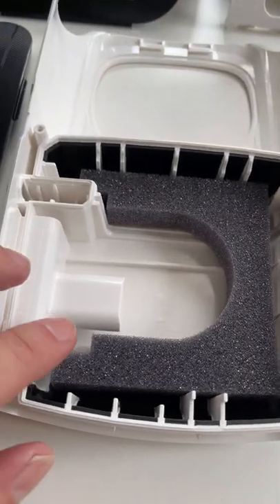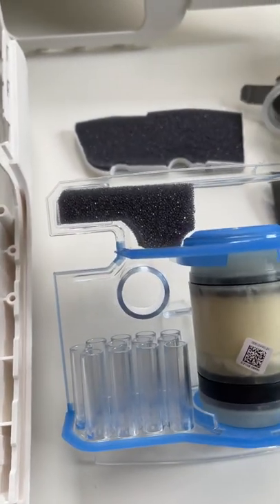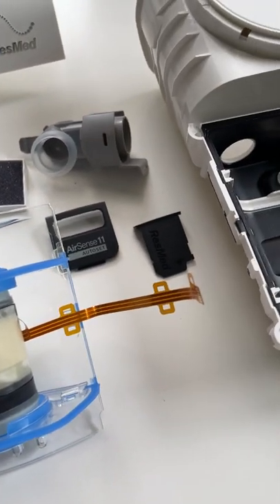These are the foam components — same sort of foam that's used in the AirSense 10. There's a little bit there, a bit more here, and there's another little bit at the back there. So a little bit more sound abatement foam than the AirSense 10.